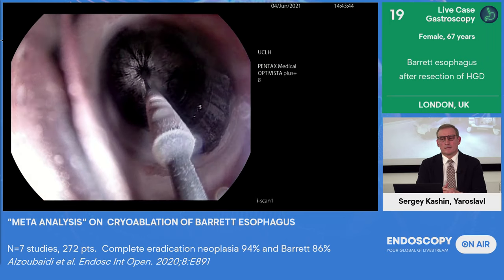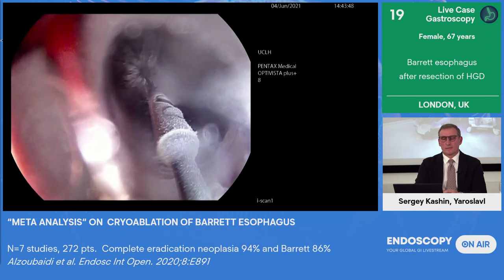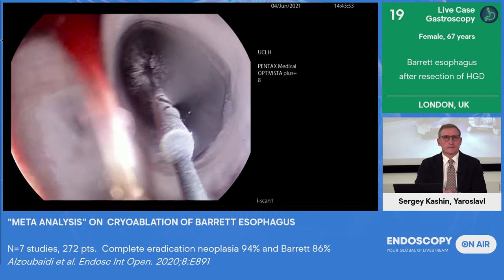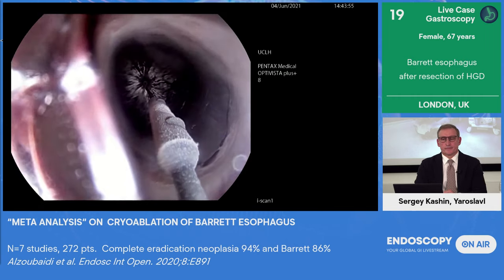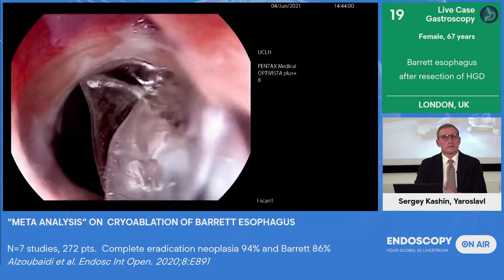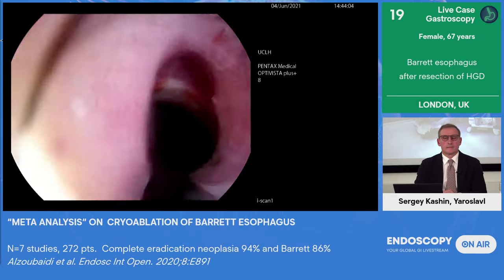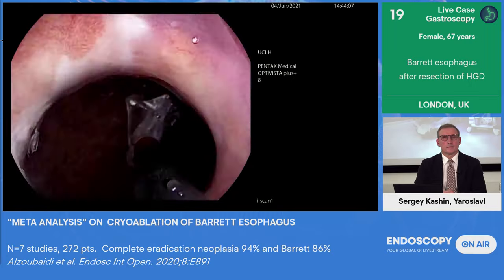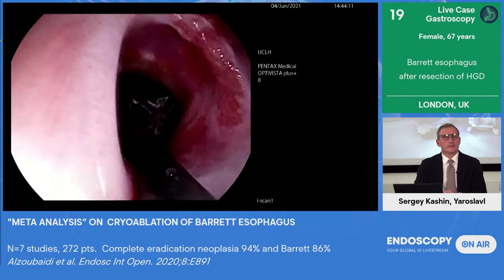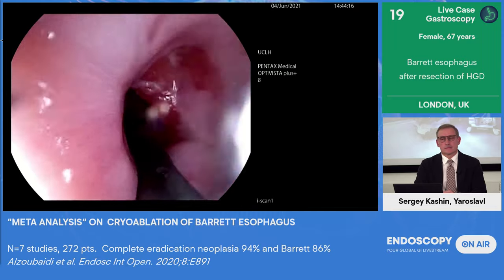What I'm going to do is just hit this area here at 1 o'clock. And full marks to the team at C2 and Pentax, these little markers have made a big difference. They give us better visibility in terms of what we're treating. It means that we don't undertreat patients, but just as importantly, we don't overtreat patients, because the risk of stenosis can be not insignificant. So what you can see here, Sergey, is we've treated within the stricture quite nicely. And in a few moments, you'll see this sort of erythema from the treated areas begin to appear.